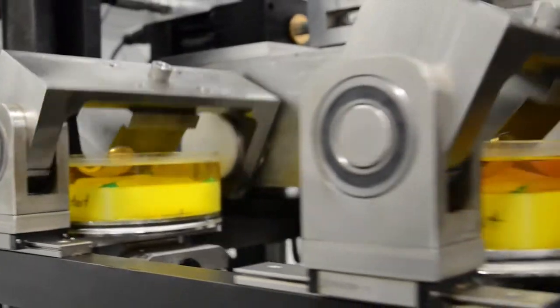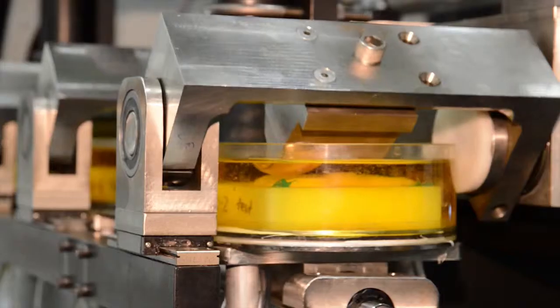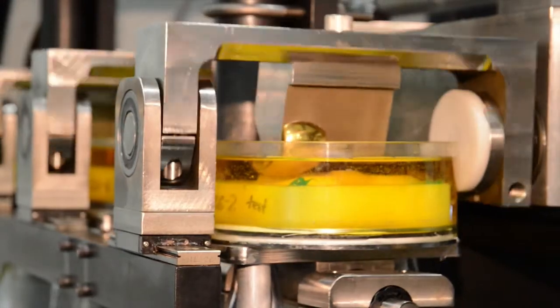We also have a knee wear simulator that complies with the ISO test requirements. We do specific testing on just the femoral component of knee replacements, and some on the tibial inserts depending on the geometry of that insert. We also do fatigue testing on tibial trays.